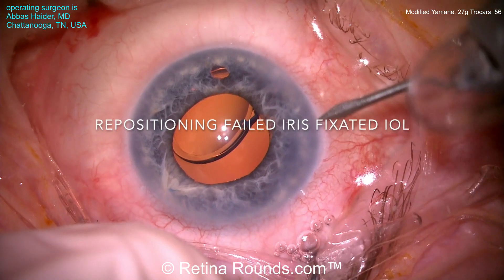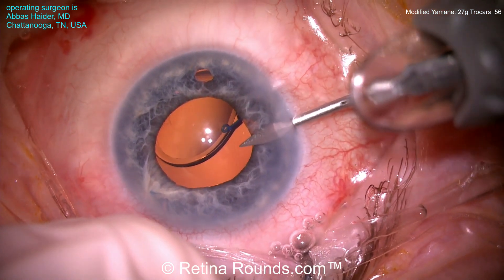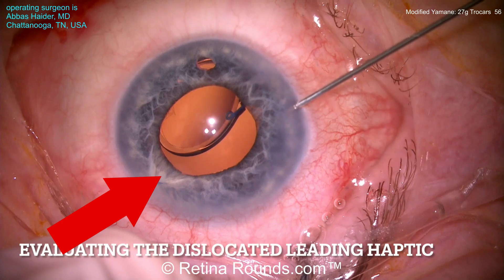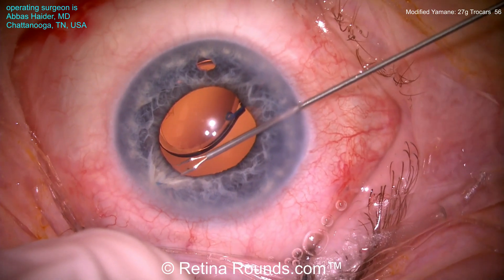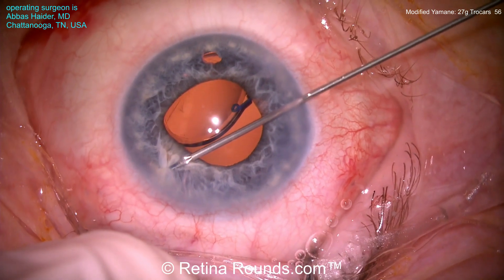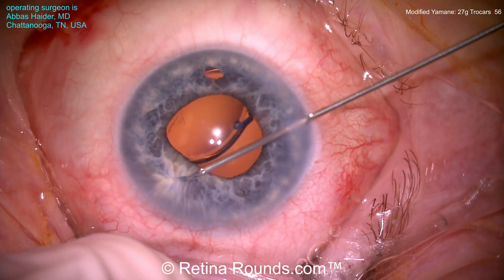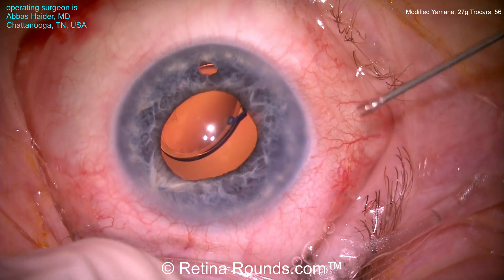Here's the patient. You can see there's a dislocated three-piece intraocular lens. The haptics of the lens are directly embedded in the iris — you can see right here part of the haptic that is in the iris. Dr. Haider has created a paracentesis and is using Max Grip forceps to try to rotate that haptic out of the iris, but it's not really moving. Rather than creating any additional iris trauma, he's going to leave that side alone and tackle it from the visible optic-haptic junction on the other side.